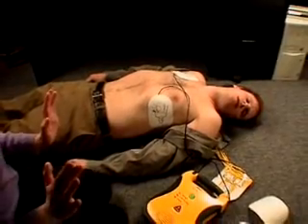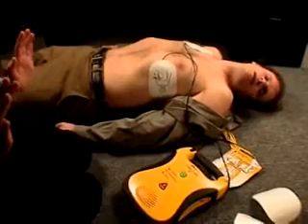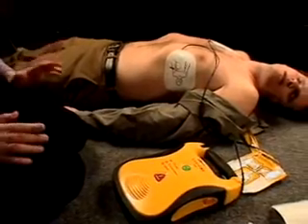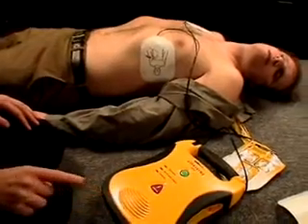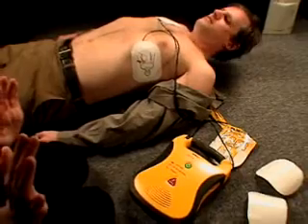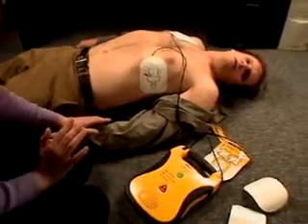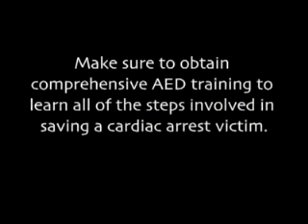Analyzing heart rhythm — do not touch the patient. Shock advised. Charging. Stand clear. Press red shock button. Shock 1 delivered. Analyzing heart rhythm — do not touch the patient. No shock advised. It is safe to touch the patient. Check airway; if needed, begin CPR. Make sure to obtain comprehensive AED training to learn all of the steps involved in saving a cardiac arrest victim.